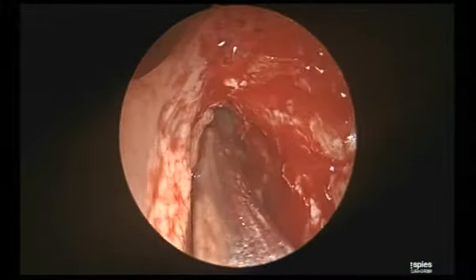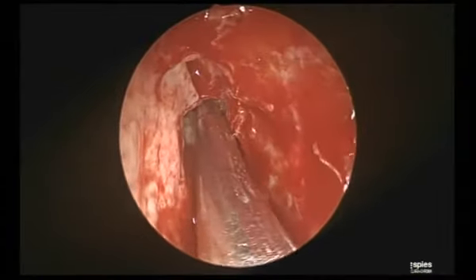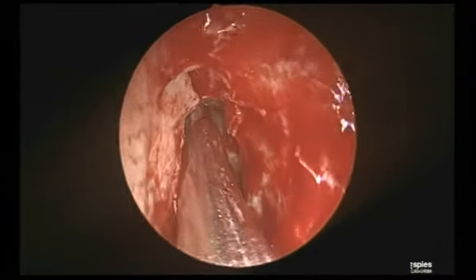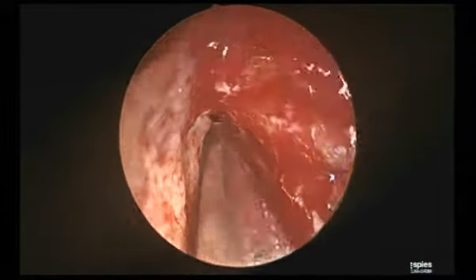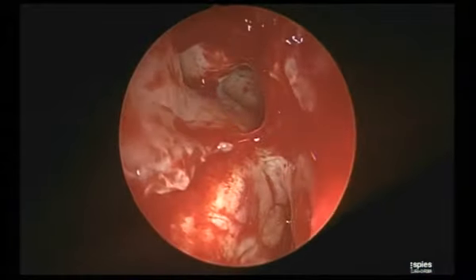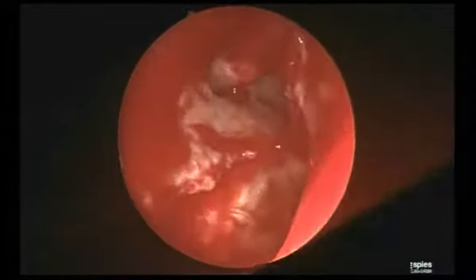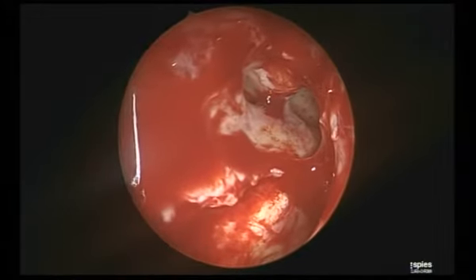Now what I am doing is, see, I can see my medial and lateral limit. Now see my anterior limit. Can you see that? This is my frontal sinus visualization. Now see medially there, into the frontal sinus. That is the intersinus septal cell going medially. Can you see?